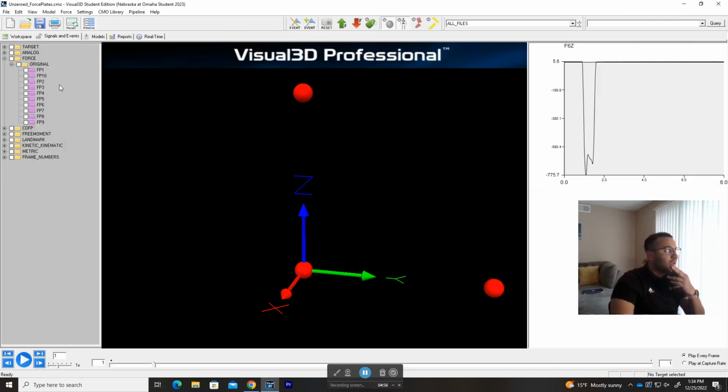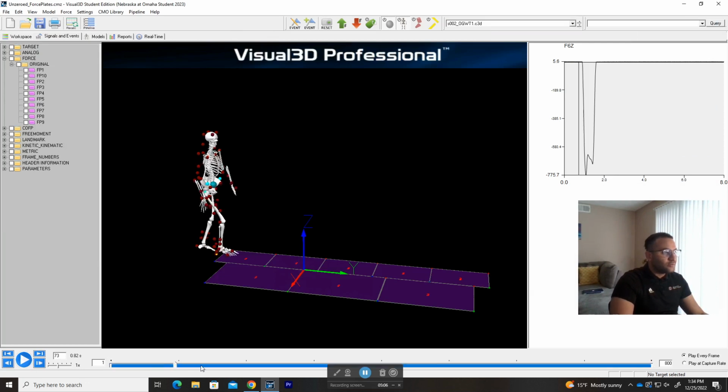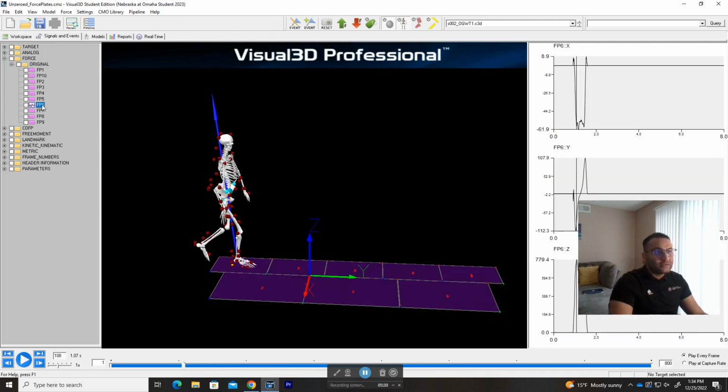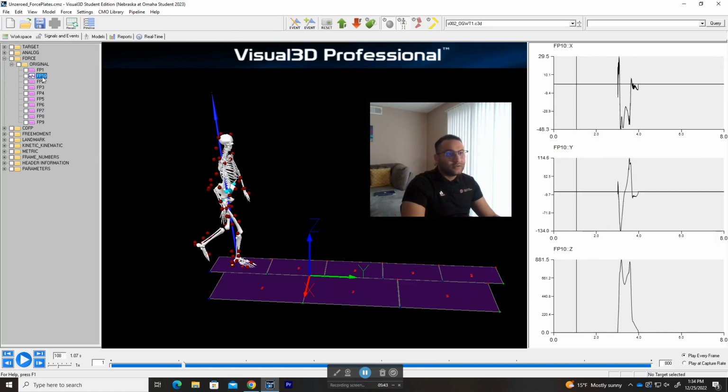And now when we go back to that force plate, it should be fixed. So this is the treadmill, so 1, 2, and then we have three force plates, 1, 2, 3, and then this is going 3, 4, 5, and then this is going to be number 6. So 6, 7, 8, 9, 10 are the force plates that were used in this trial. If you go to force plate number 6, it's fixed. 7, 8, let me actually just put it here. So 6, 7, 8, 9 and 10.